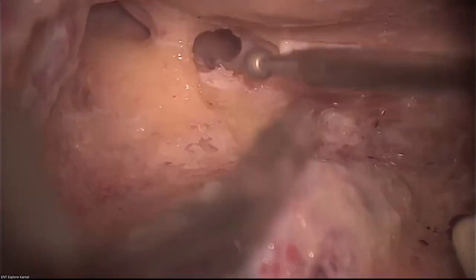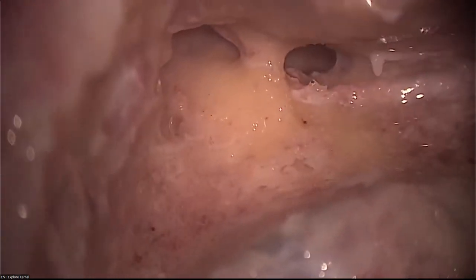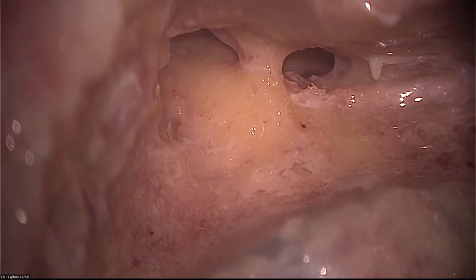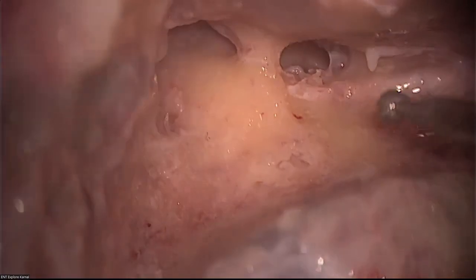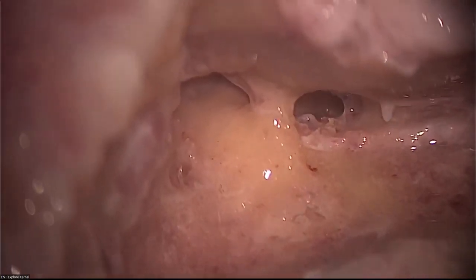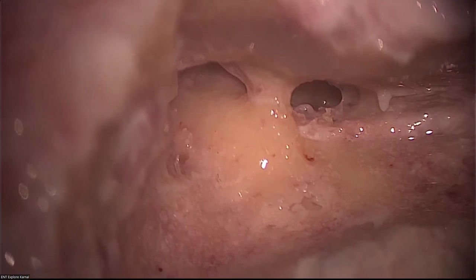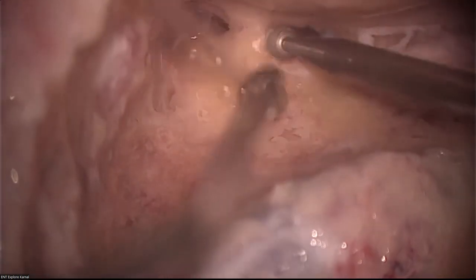See this? Now we can get a glimpse of the incudostapedial joint. The important thing at this point, before entering, I can see a glimpse of the round window niche. But still, I will widen this space further before going directly to the cochlea. I will widen all around to get the maximum space before going deeper.